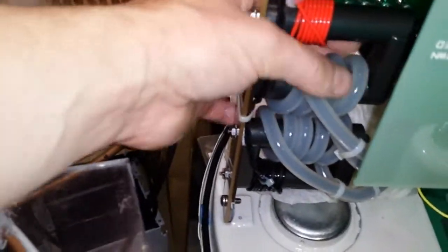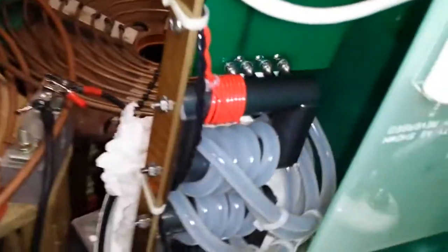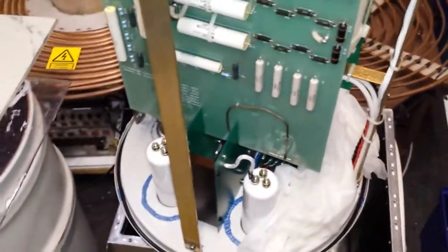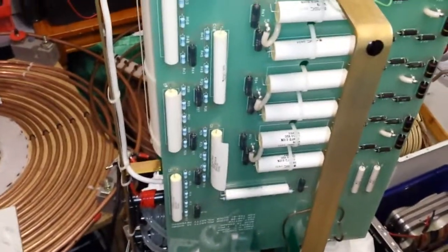These are nice as well. I do like these. They're bloody good cores. Those ferrite cores make good transformers. But for how this looks, like it's been done in somebody's basement, I would say that it's actually put together quite well indeed.